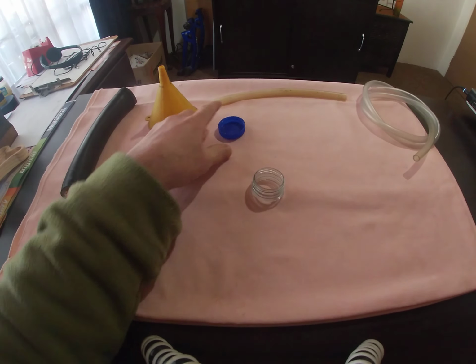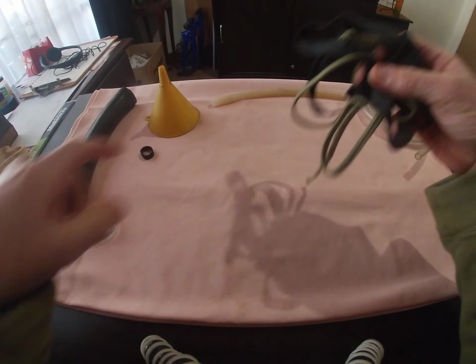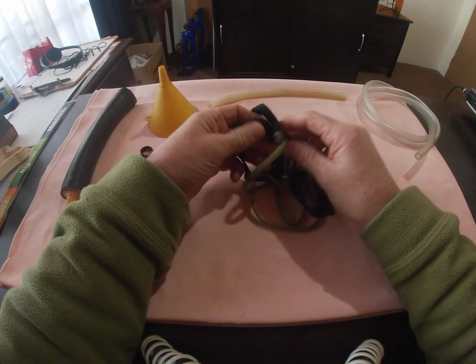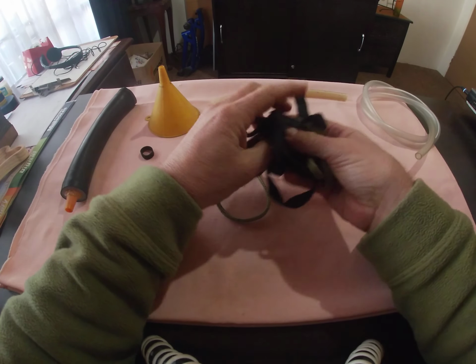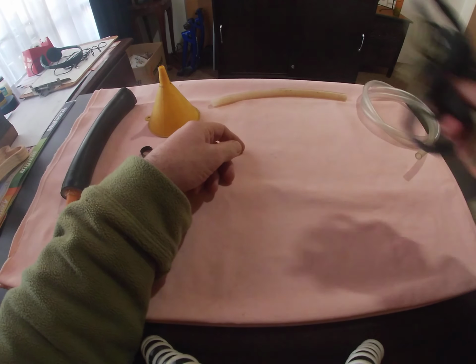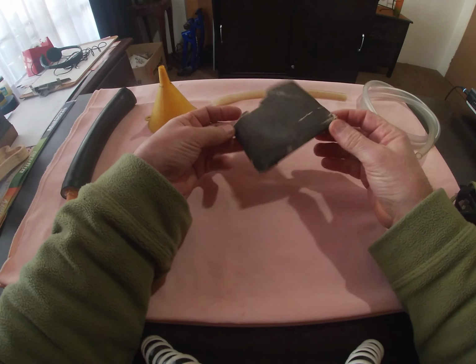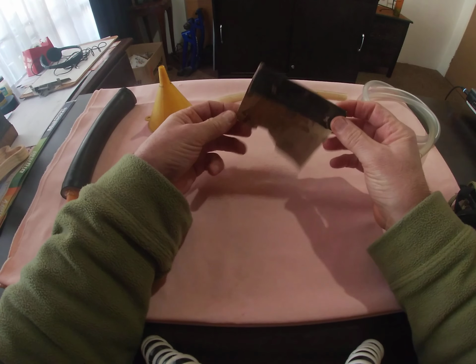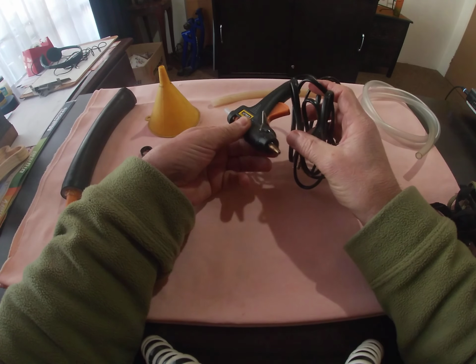Alright, and then you're going to need some shoelaces, soft ones, because they're going to make contact with your skin. And then just some things to do the build, some sandpaper, and the old reliable glue gun.